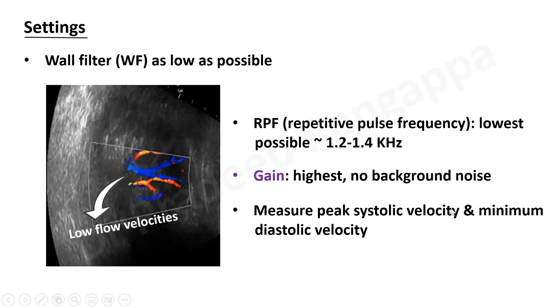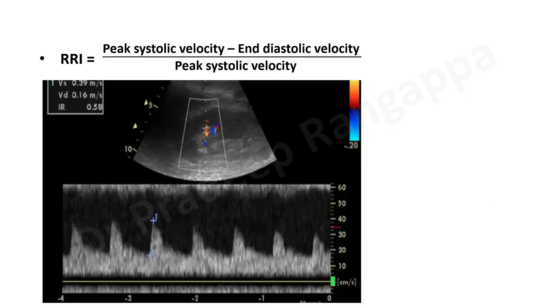Once you insoniate either the arcuate artery or interlobular arteries, you measure the peak systolic velocity and end diastolic velocity. You don't need to measure this manually. As soon as you put a pulse wave Doppler on the arcuate or interlobular arteries and get the waveform, once you put your cursor and measurement, the resistive index is automatically calculated by the machine. The renal resistive index formula is: peak systolic velocity minus end diastolic velocity, divided by peak systolic velocity.